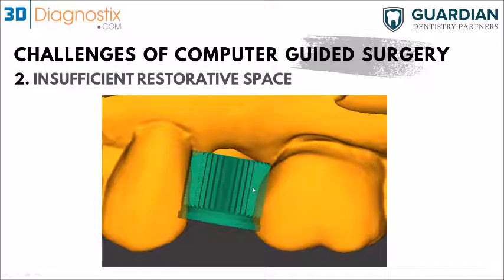So if the contact is less than 1 millimeter, or actually it's not going to be that much, we would recommend doing some either enamelplasty or crown reduction to the adjacent teeth to be able to fit the guide in without any problems or interference. But if it's too much, just like what we see in this screenshot, then the only other solution would be using a partial or partially guided surgical template. So what I would recommend here is, if the enamelplasty is going to be a lot, then to be able to seat the guide in, it only would seat if the sleeve is much smaller in size.